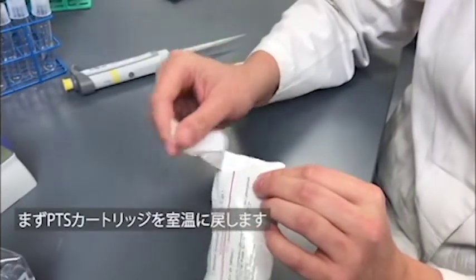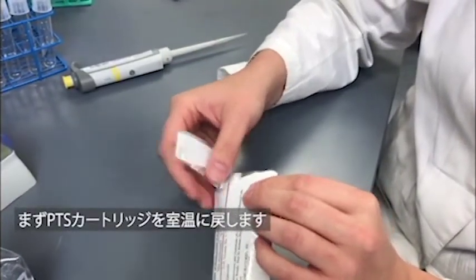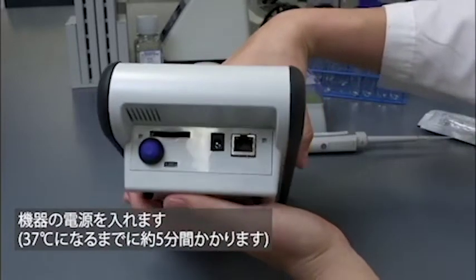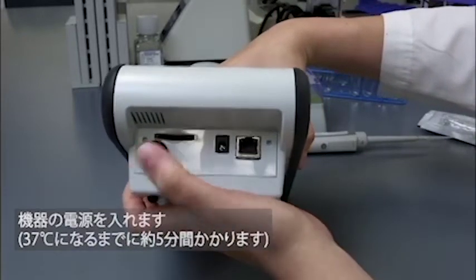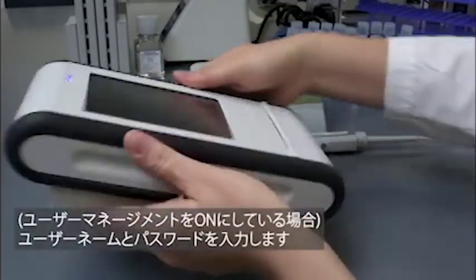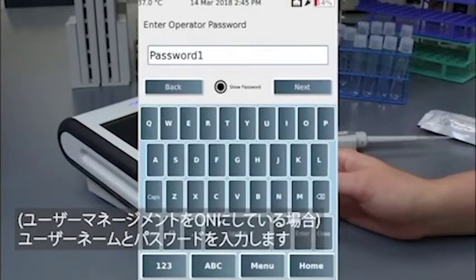Please allow your cartridges to come to room temperature before removing them from the pouch. The system will perform a self-test and will take approximately 5 minutes to reach the appropriate 37 degrees Celsius. If user management is turned on, please enter your username and password.